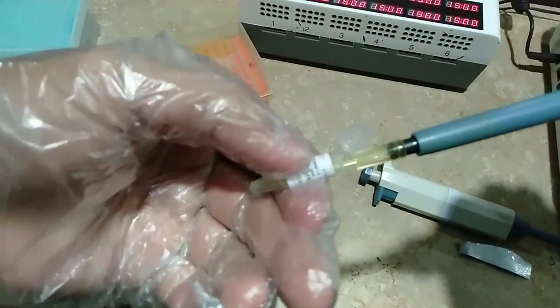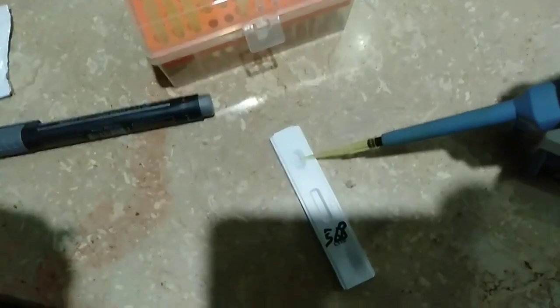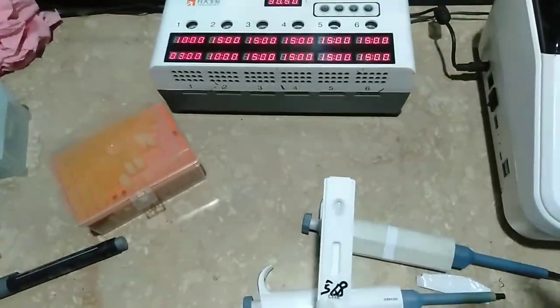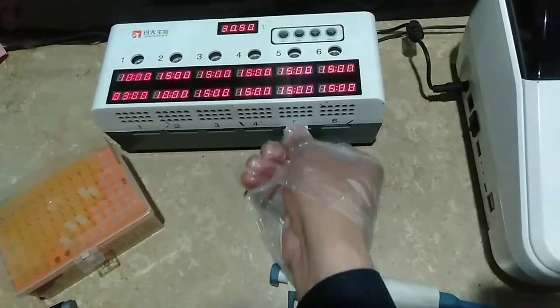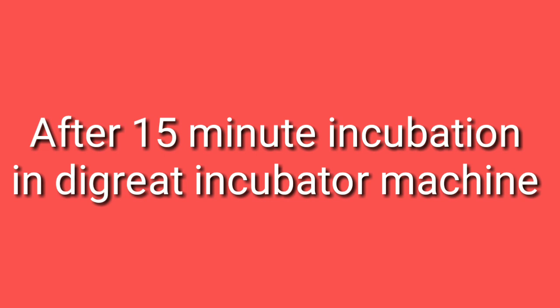So we will open it and then take 80 microlitre, then we will insert it into the well of this strip. So 80 microlitre we will insert, and then we will place it into the Digrate incubator and incubate it for 15 minutes. Remember — 15 minutes incubation in the Digrate machine.